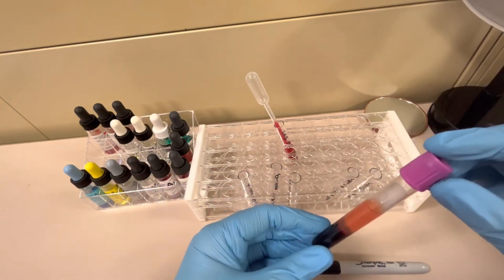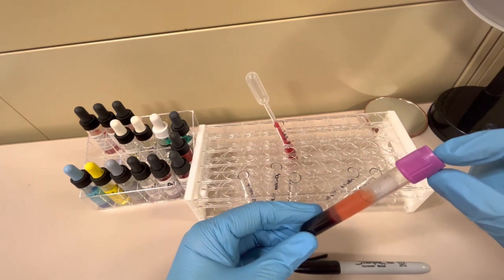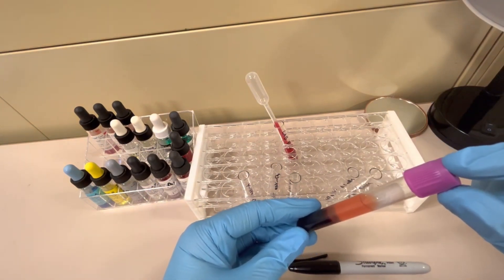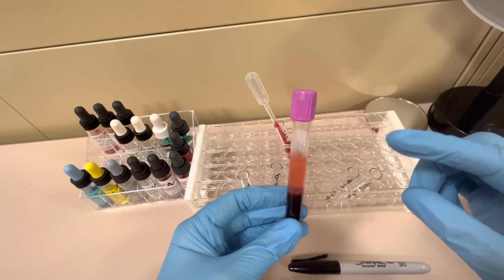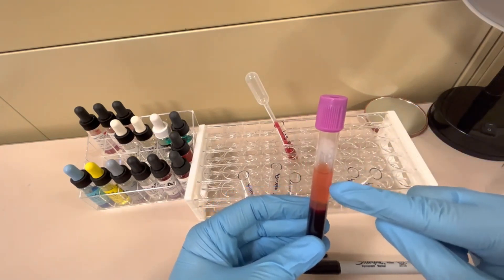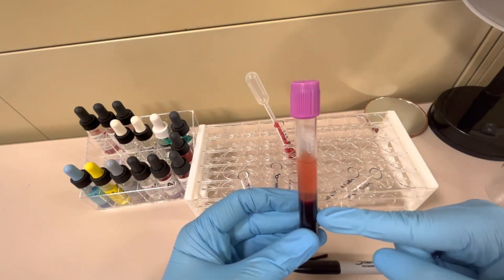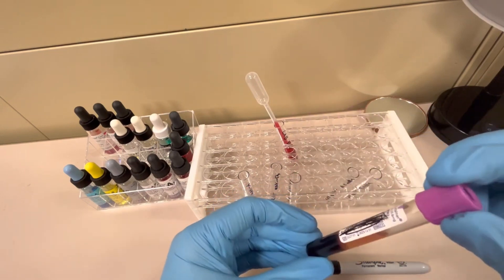For blood typing, you can use purple tops or pink tops. Either is fine. This one is properly centrifuged, so the plasma is up here on the top and the red blood cells are down here on the bottom, and of course it's properly labeled.